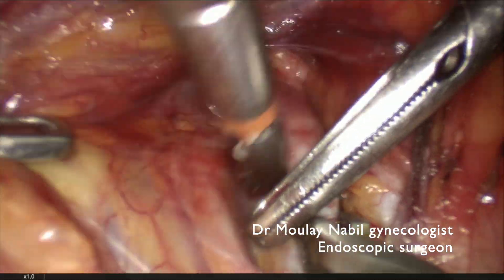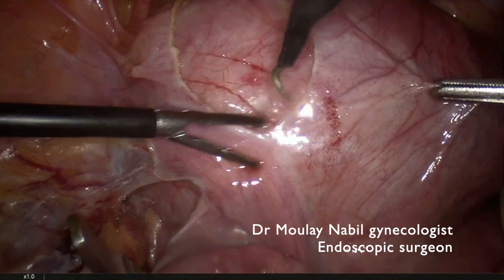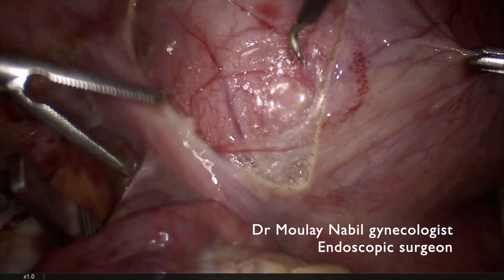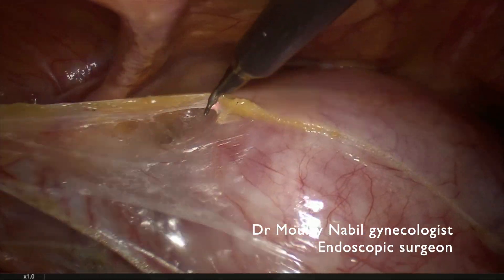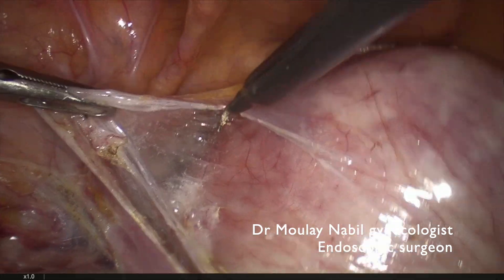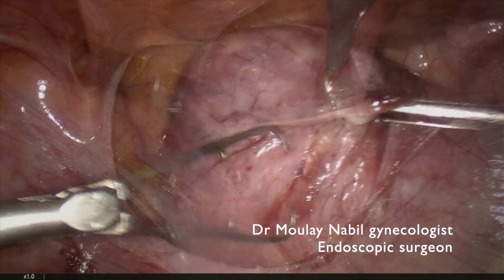The first myoma is a 12 centimeter broad ligament myoma, and to remove this myoma safely it's important to first cut the peritoneum surrounding the myoma until we reach the bladder.